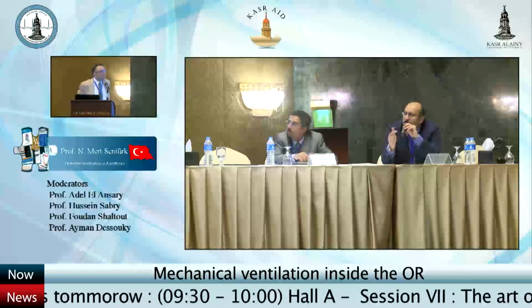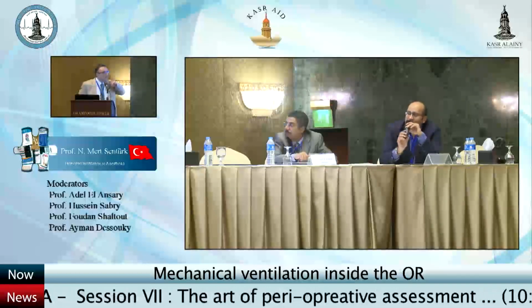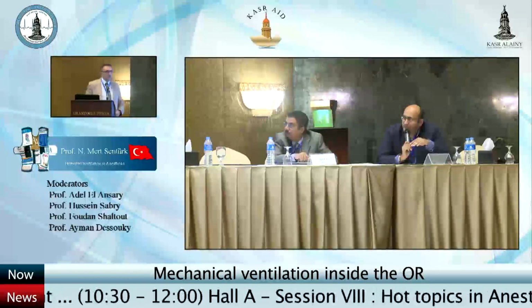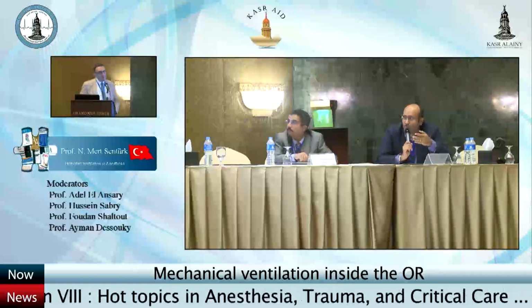How do you adjust the ventilatory setting in your clinical practice? The ventilatory setting in your daily practice, okay. How do you tailor your protective lung strategy? Do you do a routine PV curve to show the lower inflection point, or how do you adjust the PEEP, for example?